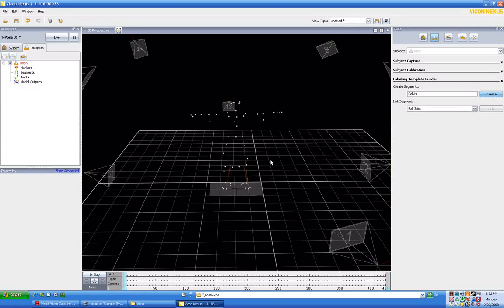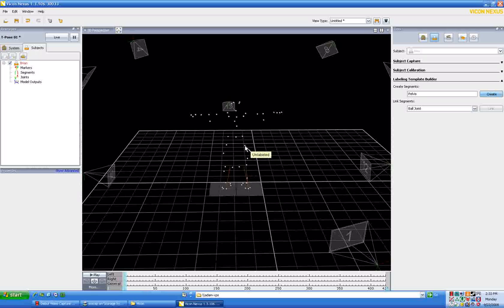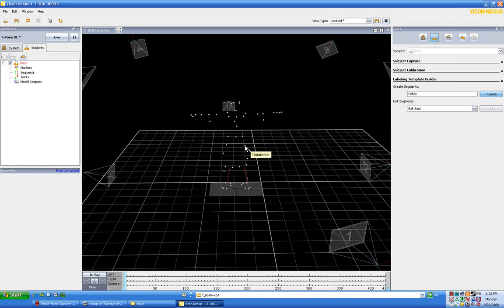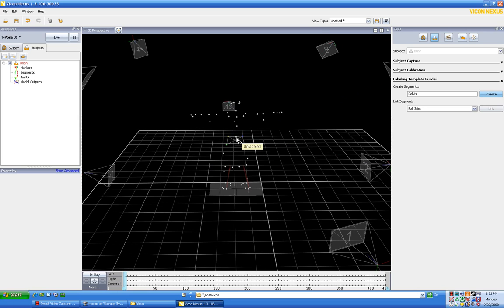The first thing that we're going to do is label long axis followed by short axis. There's a reason for this, and it has to do with some automated stuff that we'll work on later. For now, what I want you to do is just follow what I do and know that there's a reason for the order. You can override the order, but it's probably better just to learn how to do it this way. In my case, I'm going to pick the front of the pelvis on the left, the front of the pelvis on the right. I'm going to go to the back of the pelvis on the left and the back of the pelvis on the right. Then I'm going to pick the sacral or the tail dot. Those are going to be the 5 dots that define the pelvis.